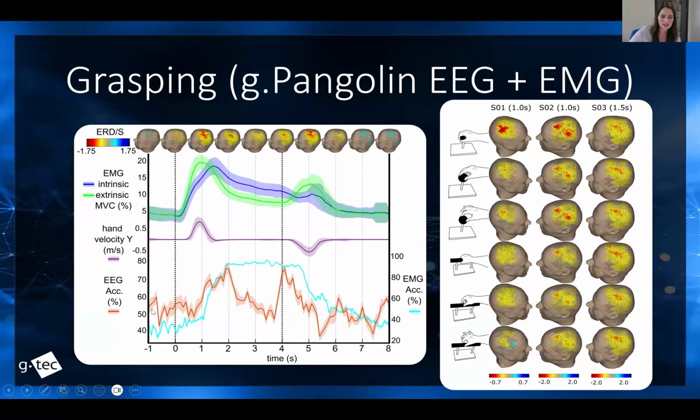In red we have EEG, for which we used a 2-class problem within one object, and you see that for a 2-class problem, the chance level is around 50%, and it starts there, and then once the movement starts, the accuracy increases to around 75%, but when the ERDs fade, the accuracy also drops, and then at the end of the trial we have another accuracy peak for the release, but with our analysis we only looked within the trial.